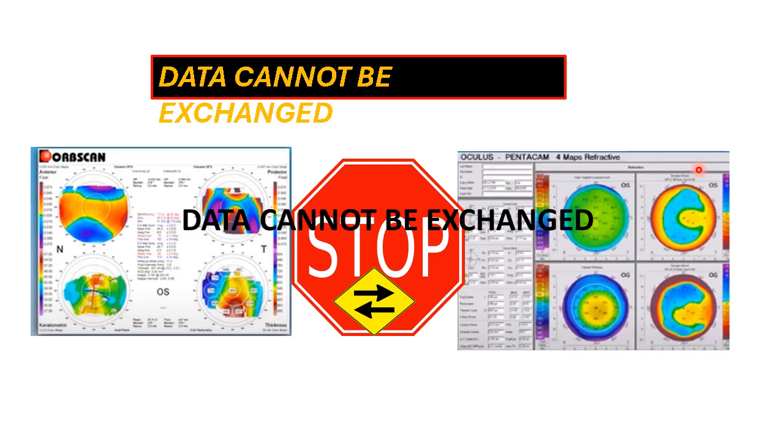you cannot, for example, use a baseline study from Orbscan, and then in the next visit use another study with Pentacam and so on. This is one of the drawbacks and disadvantages, that the data information is not interchangeable. And this is not just a problem in topography, but a problem in all the systems available in the market, given the huge evolution in the technology.